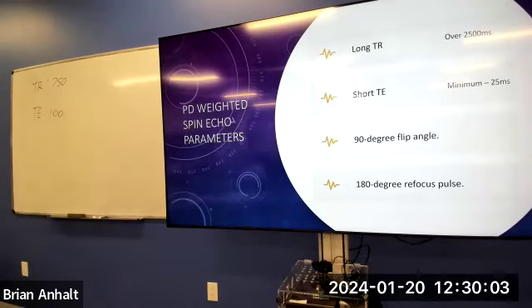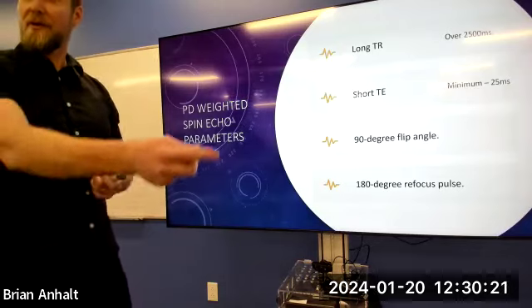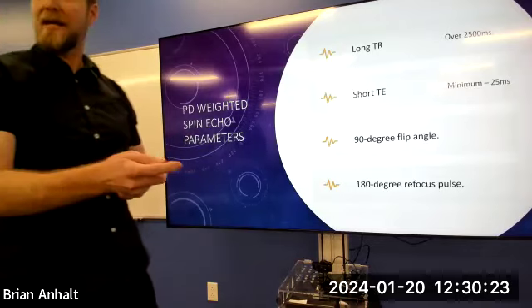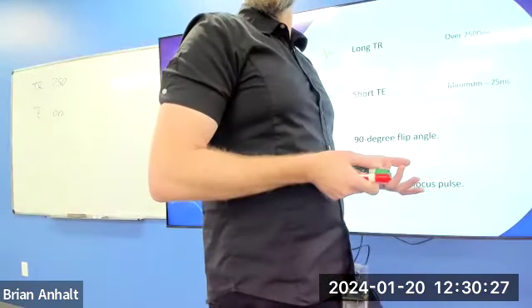Short TR, right? So we'll talk about the first one. So fat would start to recover, right? Water wouldn't. We would flip again after a short period of time. We wouldn't listen back though right away, right? So this would just start to decay. There's not much water to decay. So even though it holds on to its transverse magnetization, there's not a lot there to begin with, right? Then we listen, no signal, right?